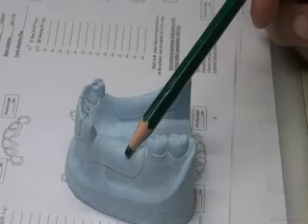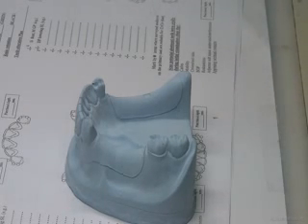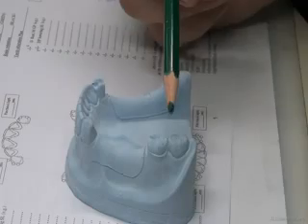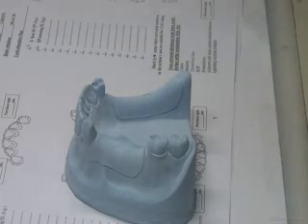But in action, this also happens, and we place a mesh in bounded areas. Bounded areas are okay with mesh, and usually we don't have a lot of resorption. This is the idea about bounded areas. Not a lot of resorption happens. That means we need space for teeth, and we usually put mesh there. Okay? We don't find places to place the teeth in the interocclusal spaces otherwise. So this is the design. We changed from the original design to another design. Okay, ready? So the idea is now clear. One of the indications for changing is aesthetics.